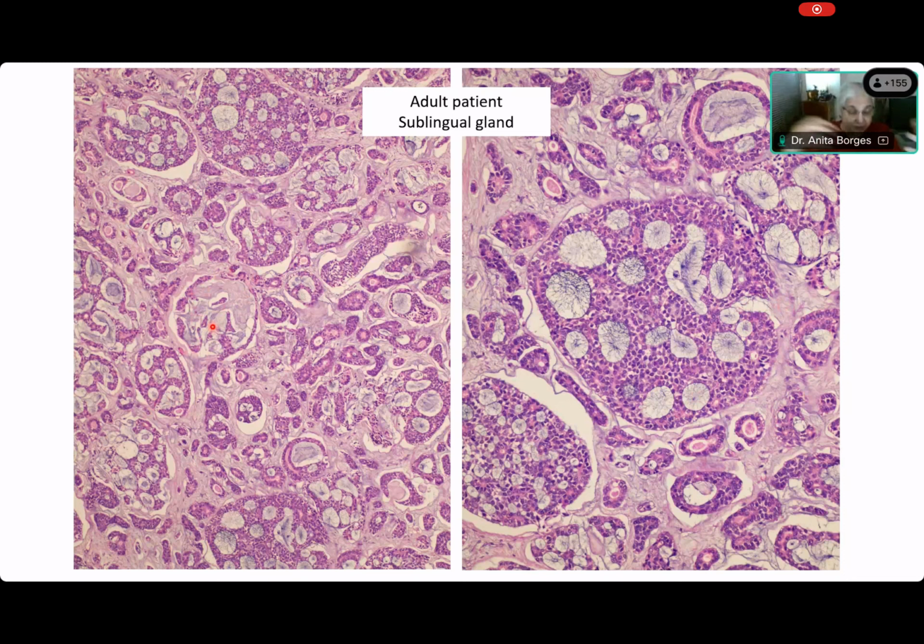In other words, there is a cell which is differentiating towards myoepithelial cells and is not differentiating towards luminal cells. Whereas this particular one that I showed you down here has good differentiation to both luminal and abluminal cells. So there is no rule that says that the outer myoepithelial cells must show you luminal and abluminal cells. It's not like that.